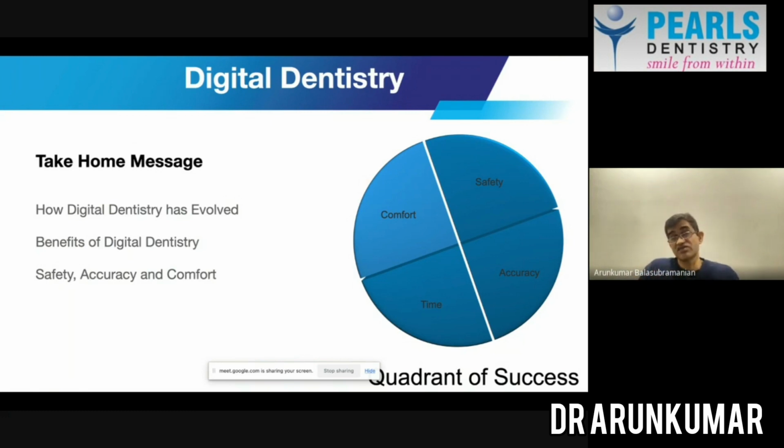Not only are we taking digital x-rays, we are actually taking a digital CT scan. We're also taking face scans. We also saw the benefits of digital dentistry, and how much taking impressions of the patient's jaw has evolved. We saw how the patient need not have impression material in their mouth, how the bad taste of the impression material and the gag can be avoided, and how fast the impression can be made. Within 1 minute they can make the impression, and it is very accurate.